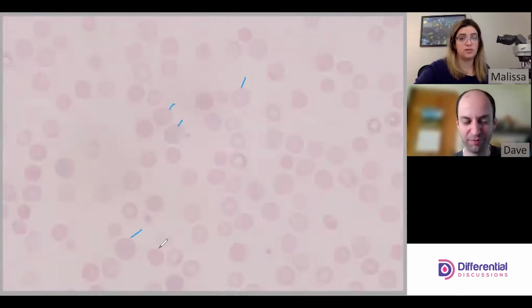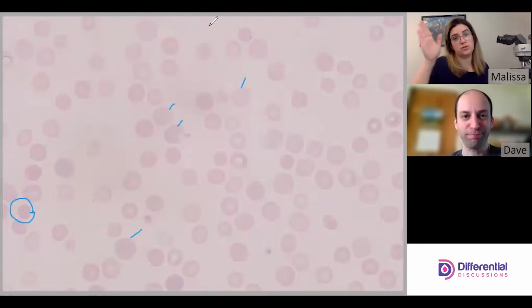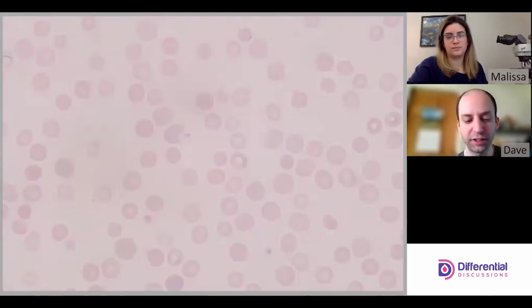Yeah. They look spherocytic, and spherocytes are not usually that large. Right. Like this guy looks like a true spherocyte. Exactly, right? That's an exaggerated real spherocyte. So comparing this real one here to these pseudo spherocytes that we have, you can tell that when you go too thin on the slide, this is what they look like. It looks like, oh wow, there's a whole ton of spherocytes here, but you're in too thin of an area.